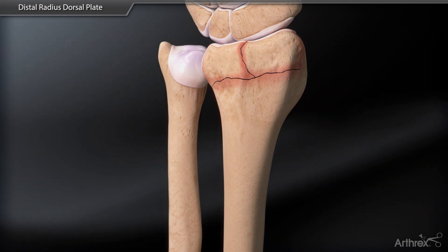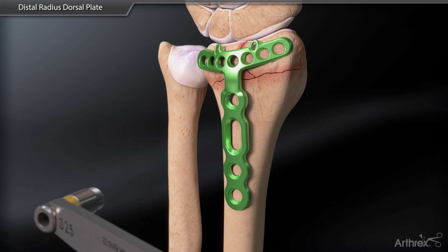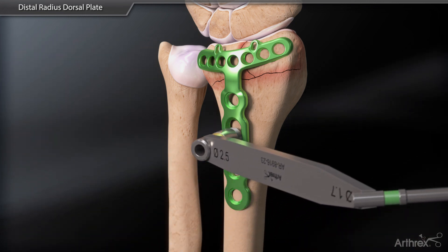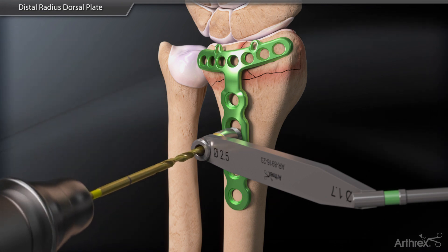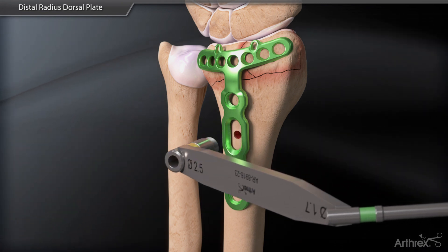Next, position the appropriately sized plate to capture the distal subchondral bone and insert a non-locking 3.5 mm screw into the oblong slot for provisional fixation using the drill, drill sleeve, and depth gauge.